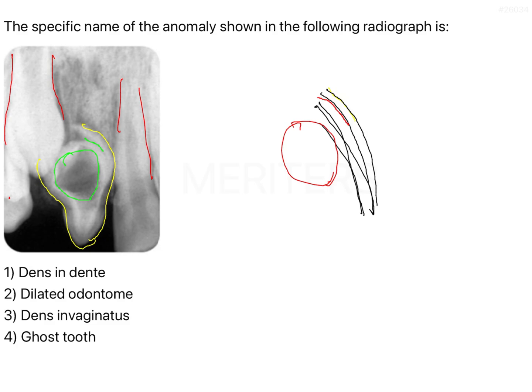Within this radiopacity you again have an entire structure of radiolucency. So basically you have radiopaque, radiolucent, radiopaque, radiolucent — and it all looks like tooth-like structures. Whatever is in yellow is the crown of the tooth, then within the crown you have a small radiolucency, and again within that radiolucency you have a tooth-like appearance. The pink outline is also radiopaque and looks like a tooth — so basically it is a tooth present within a tooth.